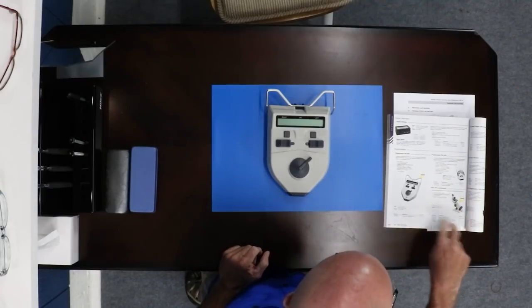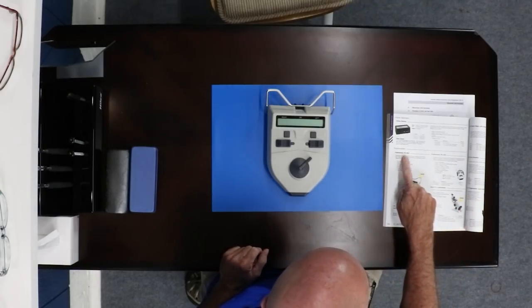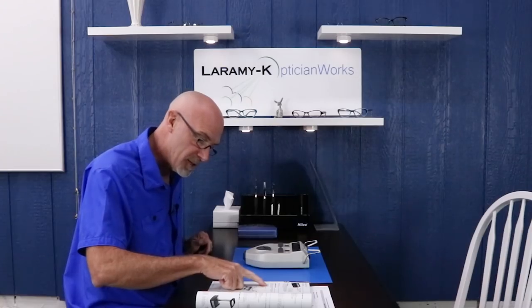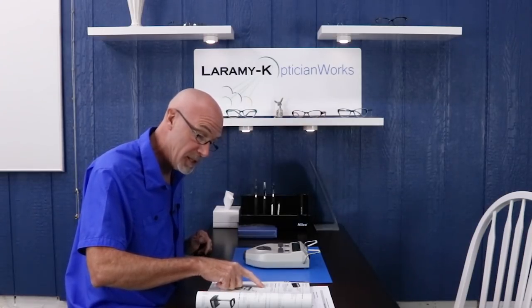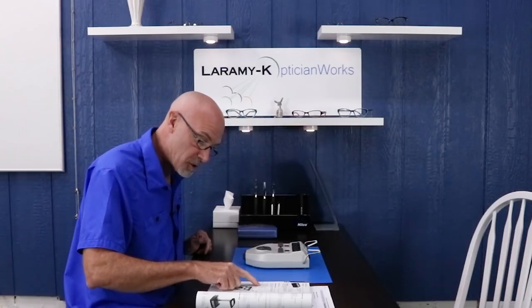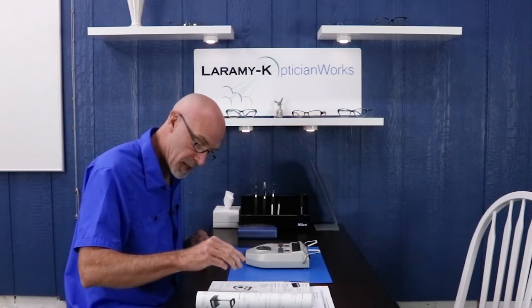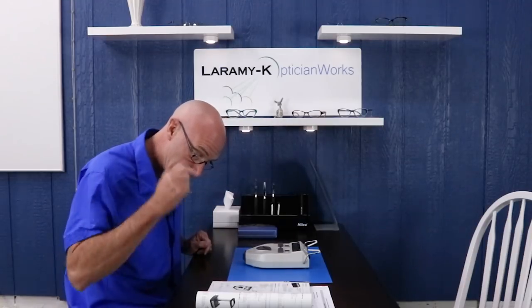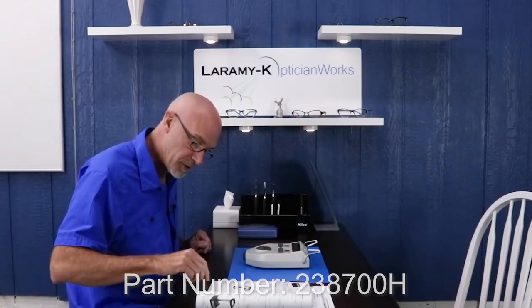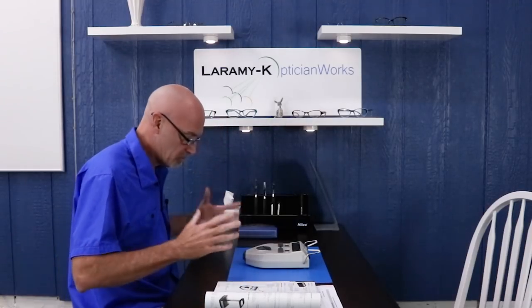In the current Hilco catalog they have two pupillometers. This particular one is their HX-400 — H as in Harry, X as in X-Ray, 400. It is a self-calibrating liquid crystal display with an adjustable LED light source. It occludes right and left, and does binocular and monocular within plus or minus half a millimeter. It's adjustable for distance, 30 centimeters to infinity. It has a one-year warranty, part number 238700H, and it sells for $375, which is kind of normal.